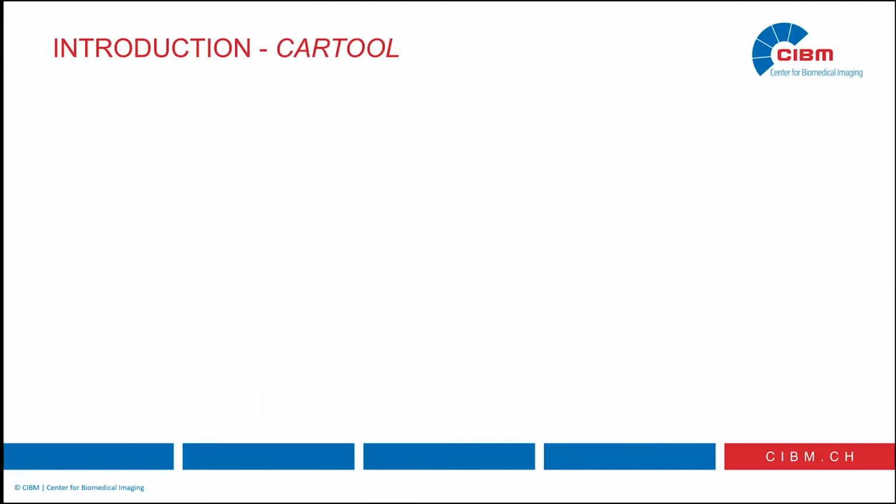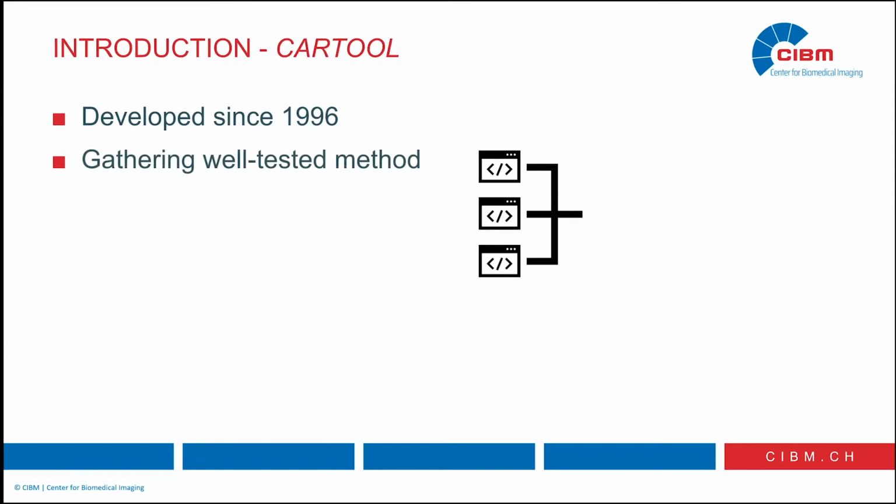So EEG source localization from high density EEG. The other thing I'm going to use a lot is the Cartool toolbox that we developed at the lab since 1996 already. So it's about 24 years development. So what's the idea of this toolbox is we still have people working separately on their own method. They develop their own toolboxes.